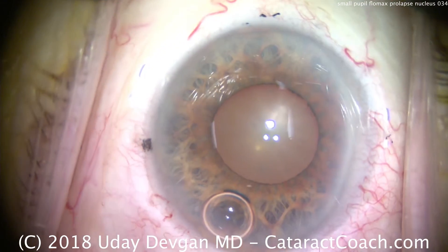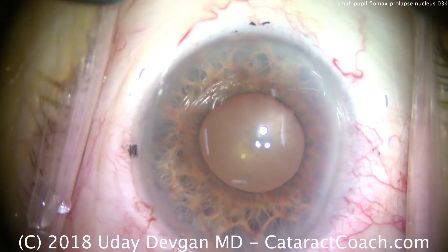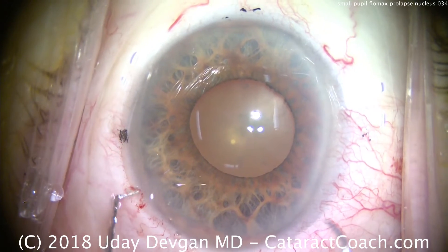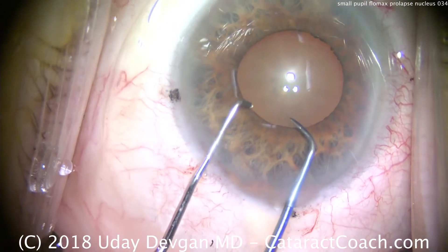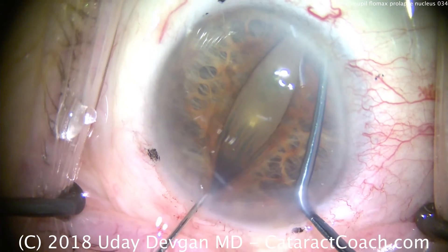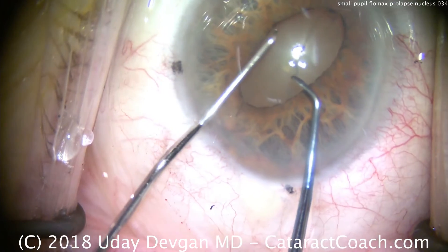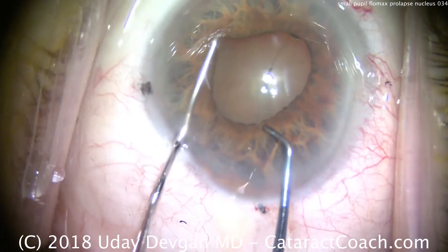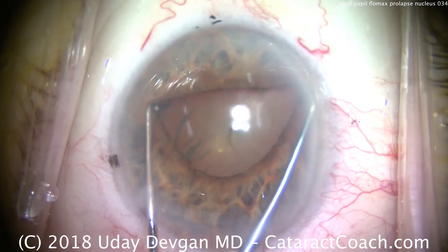We're going to start off here by using two choppers to stretch the pupil. There are specific devices available for pupil stretching — instruments designed just for that — but here, two choppers is sufficient. One chopper through the paracentesis to hook the iris, the other through the main incision. That is most of the work: pushing out towards the angle of the eye. We've got a good stretch there. We'll do a little bit in the opposite direction. We can grab this iris and push these apart. I think we're pretty good.